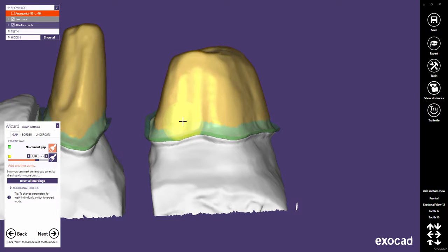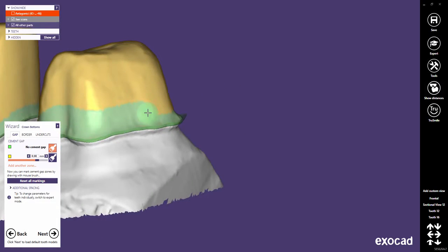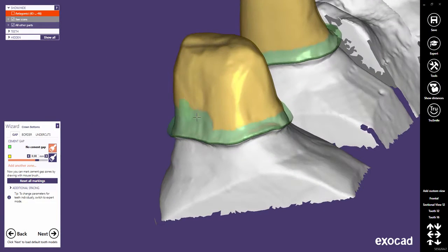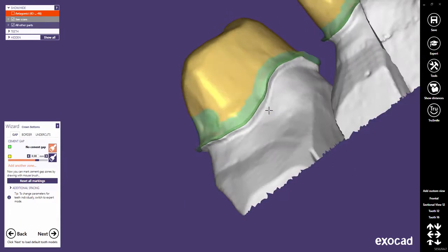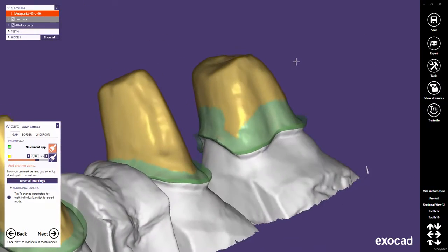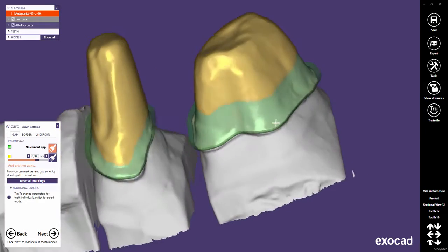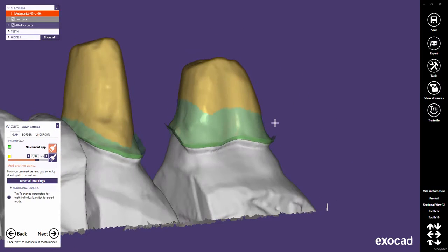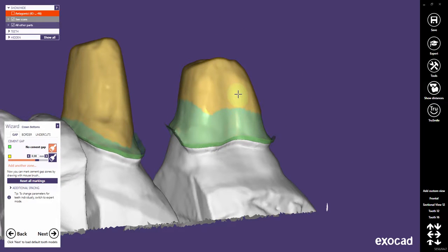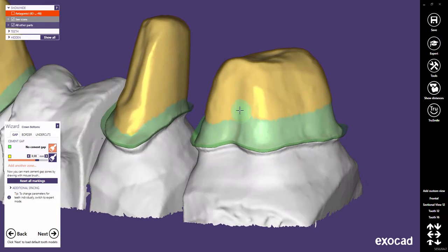With Shift and the mouse wheel, you can change the brush size. Extending the green zone without cement gap in the margin area will certainly increase friction. Use Shift to inverse the brush interactively. This allows you to delete brushed parts very easily.